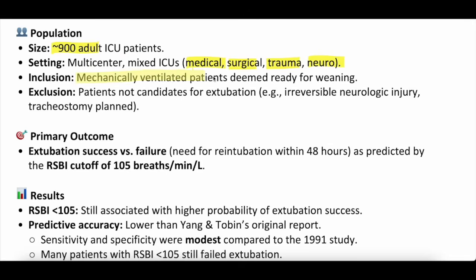They looked at all mechanically ventilated patients deemed ready for weaning, right? So the patients that met those other criteria: hemodynamic stability, oxygenating appropriately, ventilating appropriately, mental status improving, et cetera, et cetera. And the primary outcome was extubation success versus failure at 48 hours. So did they need to be re-intubated by the 48-hour mark? And they used the RSBI cutoff of less than 105.